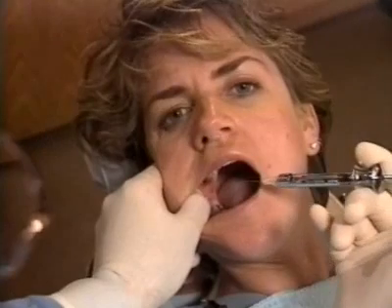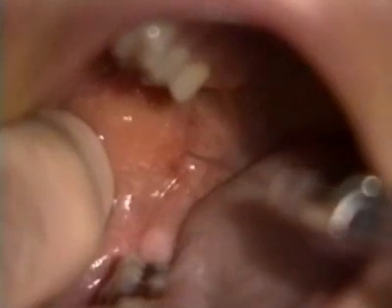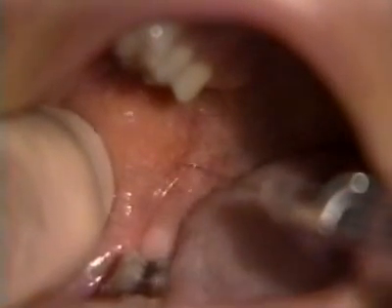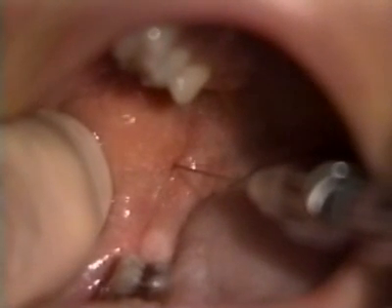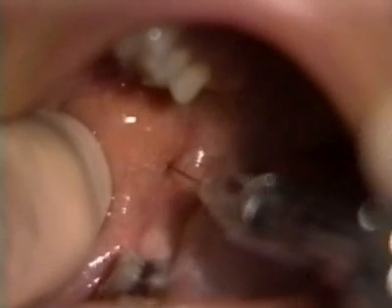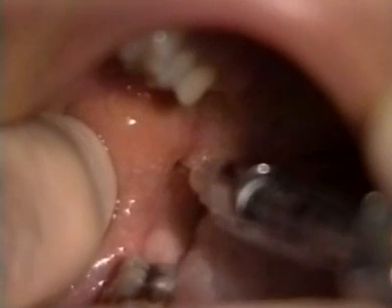With the syringe oriented over the opposite premolars, the needle is advanced to the insertion point, lateral to the pterygomandibular raphe, and at the height of an imaginary line bisecting the thumbnail. The needle is then inserted slowly through the mucosa and buccinator muscle and into the pterygomandibular space. A few drops of anesthetic solution delivered as the needle is advanced may help reduce the discomfort of needle insertion.